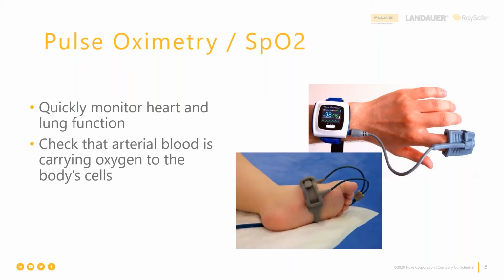Okay, keep going. So here's a picture of a foot, and where it could be hooked up to an infant, since children are notoriously difficult to put something on their finger and keep it on their finger. So the mechanical interface changes based on who the patient is and what you're trying to measure.